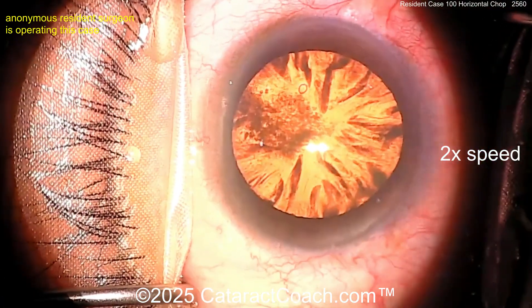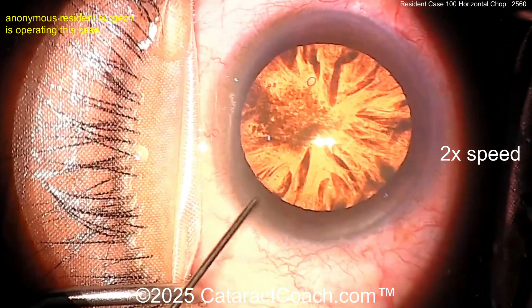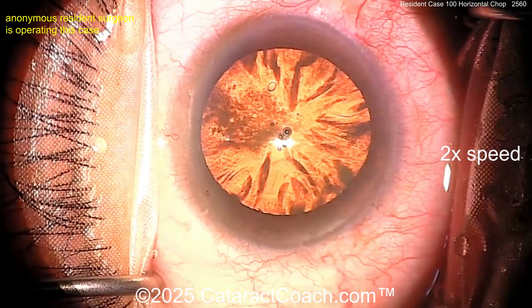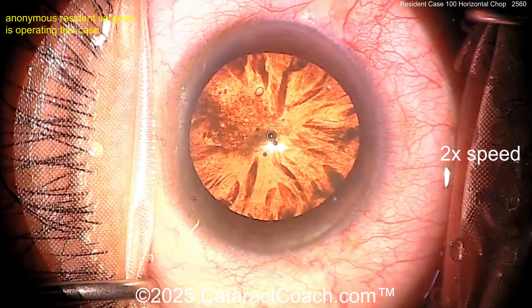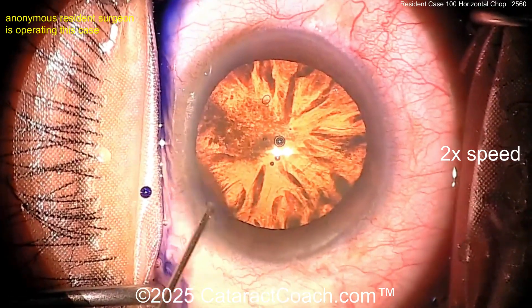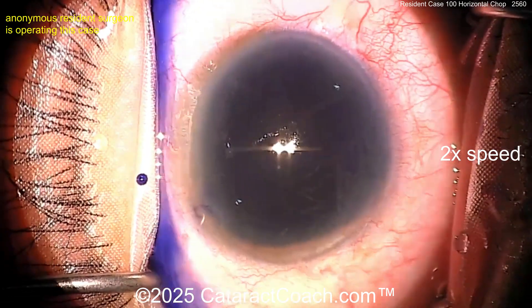You can see it's a nuclear cataract — looks like some posterior subcapsular changes as well, and certainly some cortical changes. Now maybe a little anesthetic going inside the eye. Here you see the surgeon optimizing the red reflex. I'd also turn on the paraxial lighting.